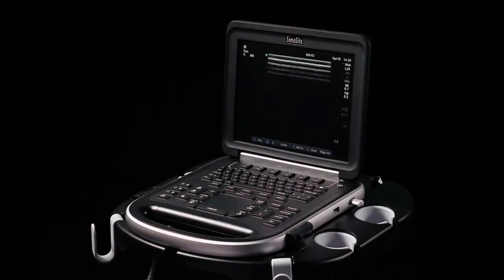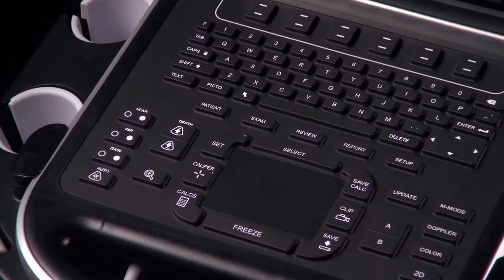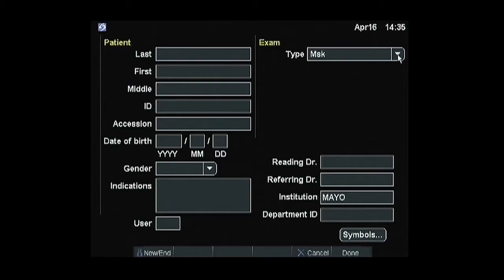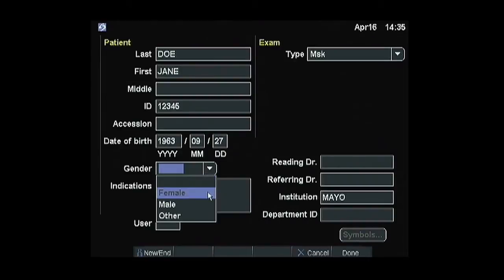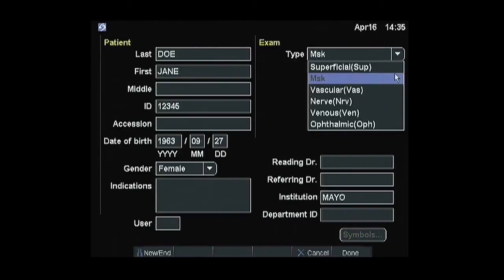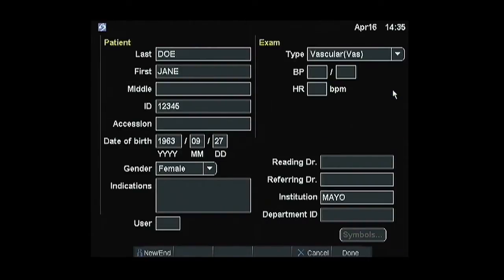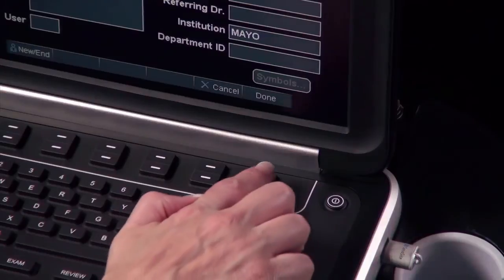This short video will outline the steps to optimize the ultrasound system to perform an examination. To start the study, press the Patient key. Enter the information into the appropriate fields, including patient name, ID number, date of birth, gender, and exam type. When you have completed patient information entry, press Done.